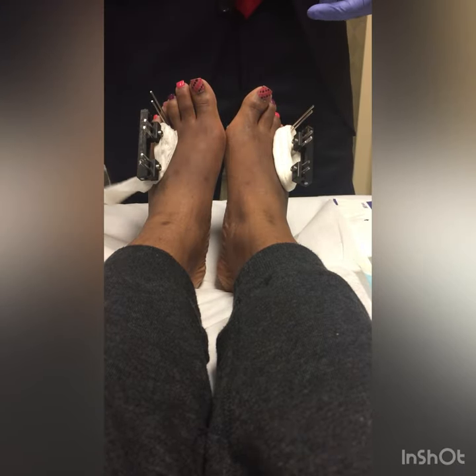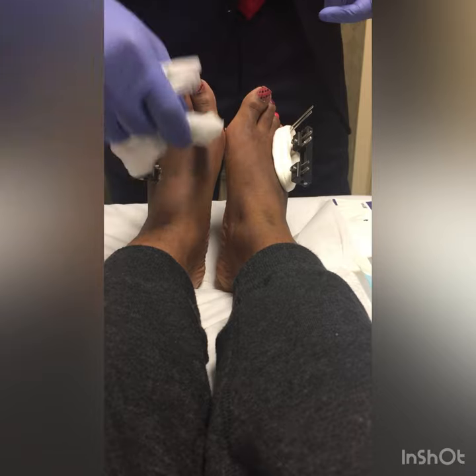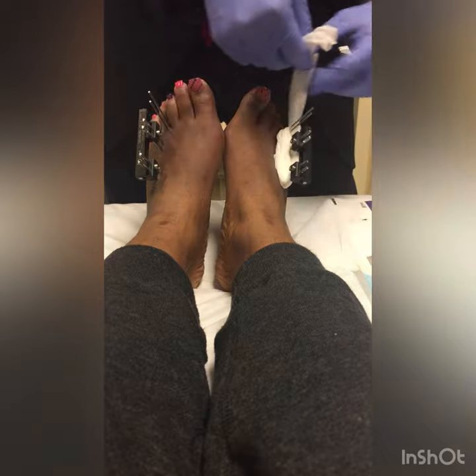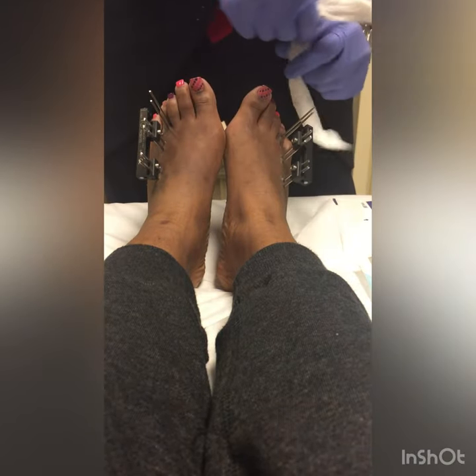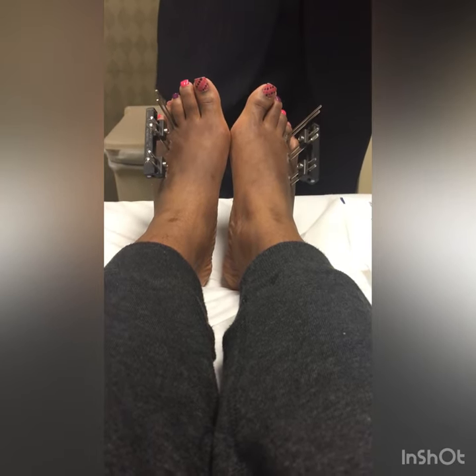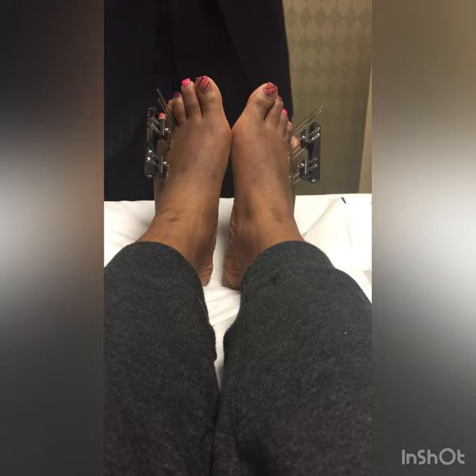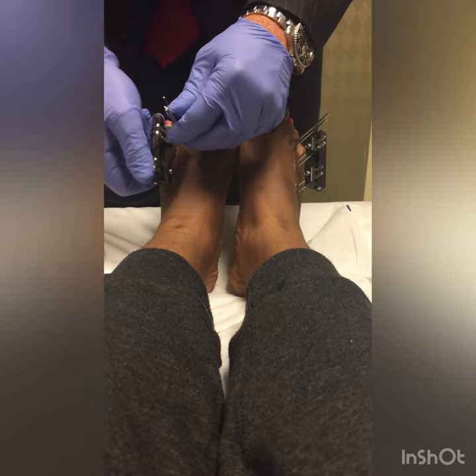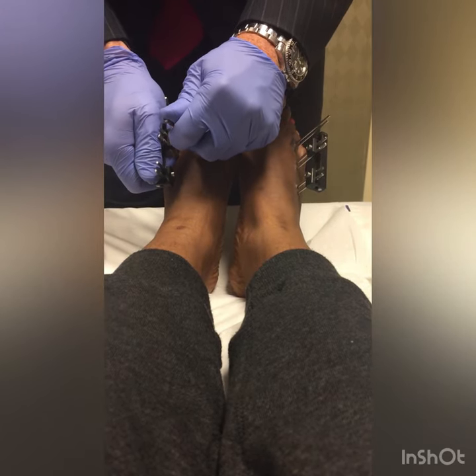See how nicely she wrapped that. The purpose of the gauze is so that it keeps the skin from riding up the pin, because that's what creates pin track infection — the swelling and de-swelling. It's like a piston up and down the pin, so by jamming in the wraps it works. That's all you do — the gauze and jam it in there.